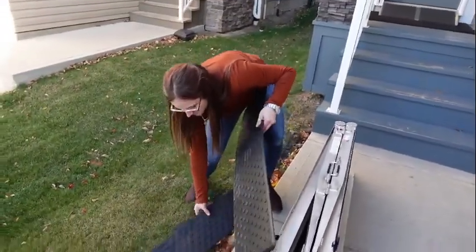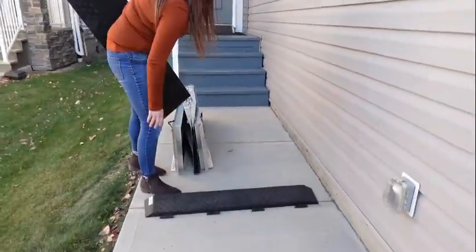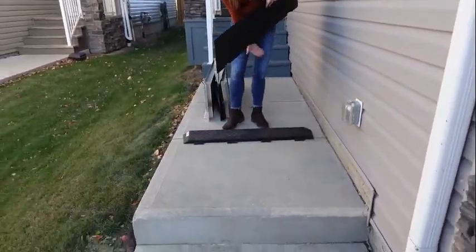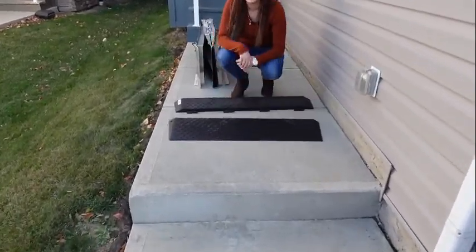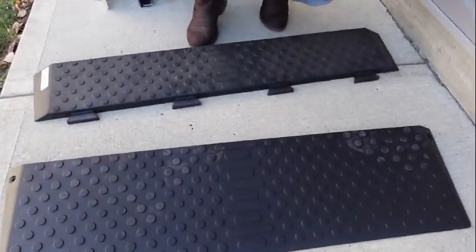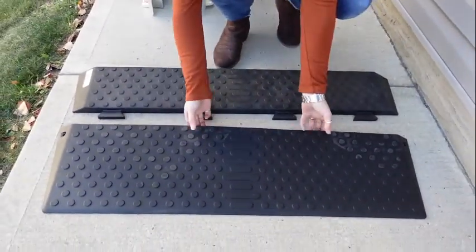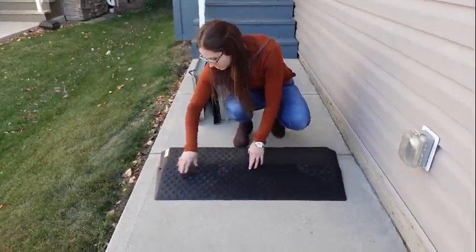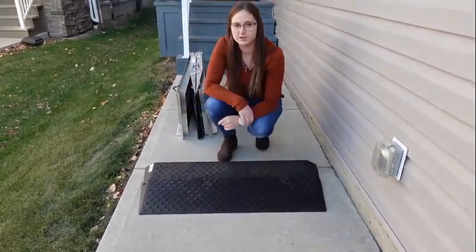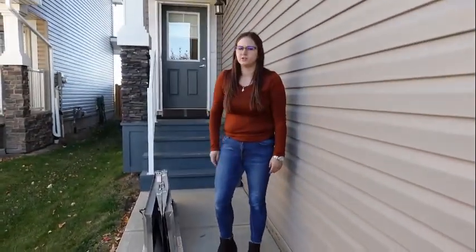These are the rubber threshold ramps. These ones are good for both inside and outside and they come in pieces. Depending on the slope you need, you just pick those pieces — they're like little Lego pieces. If you need it higher and higher, you just put the pieces together. The maximum you can achieve on these is four inches. Right here it's just a one-and-a-half inch rise.